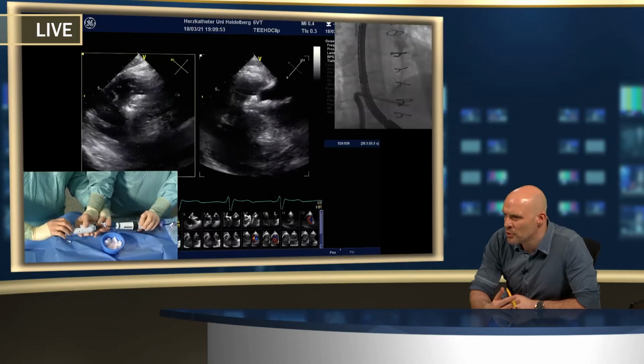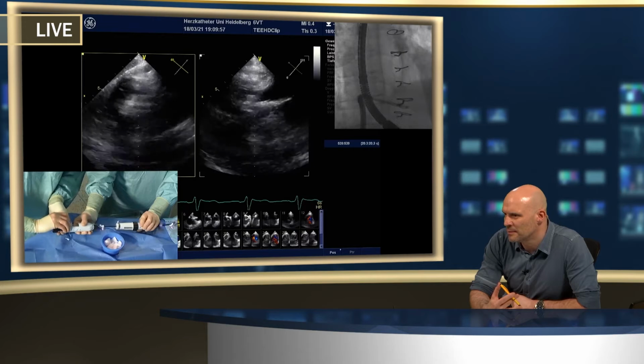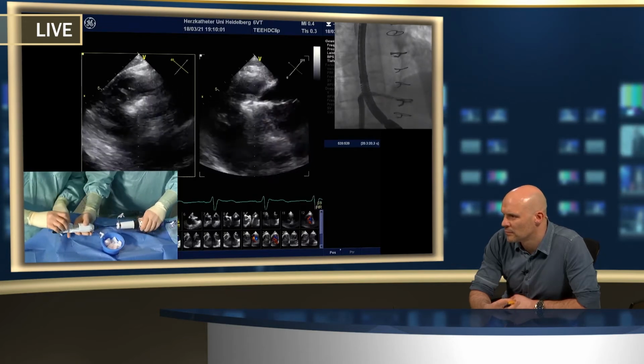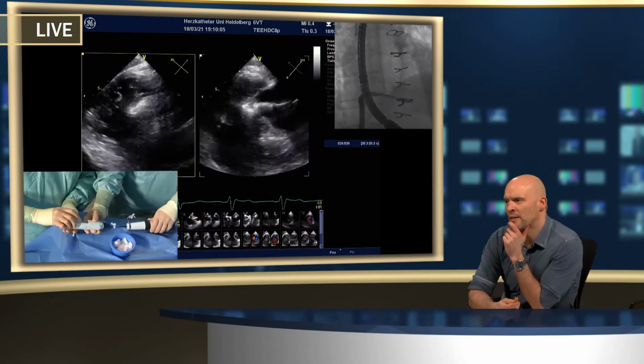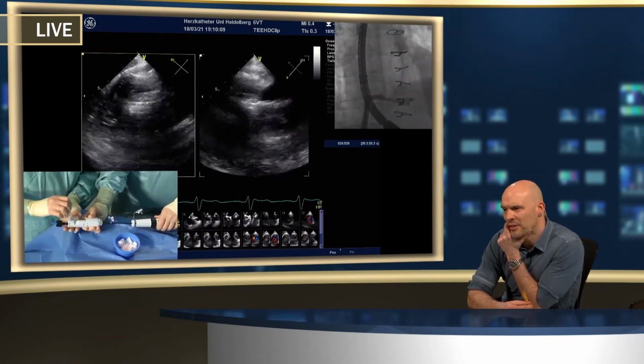So Philip, you're addressing one of the questions from the audience, where you discussed the benefit of using PASCAL Ace. So especially when you approach the commissures, you would prefer the PASCAL Ace, right? Correct. Yeah. And another question from the audience is: Do you anticipate using more than one PASCAL device?